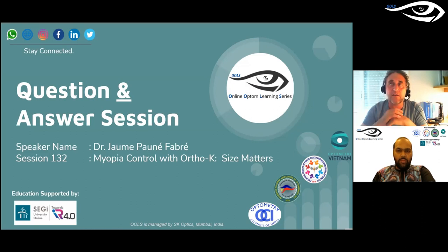One design software is iSpace from Australia. Another is GP Designer from Italy. And another is OrthoTools from Eddie Chow. You could find all those systems to design lenses on the internet very easily.